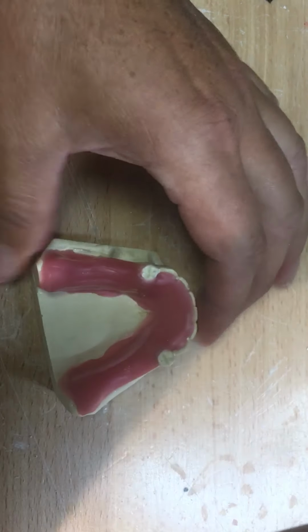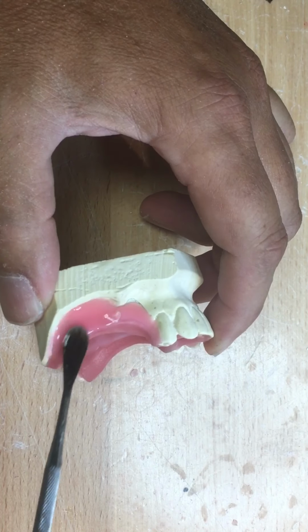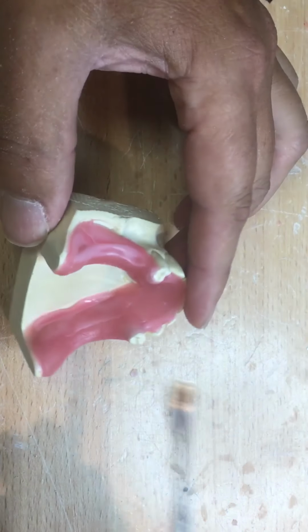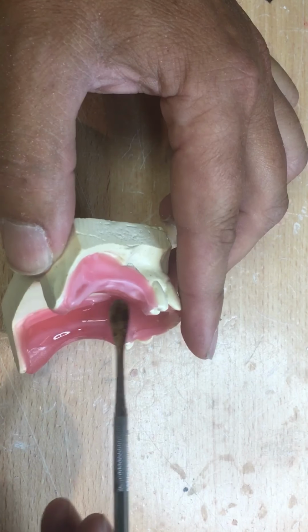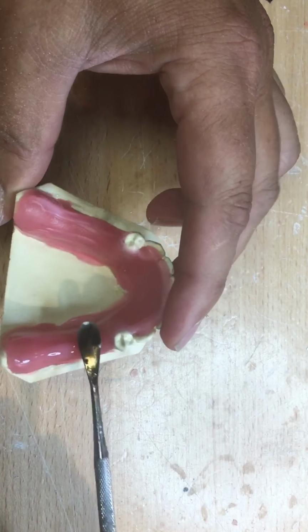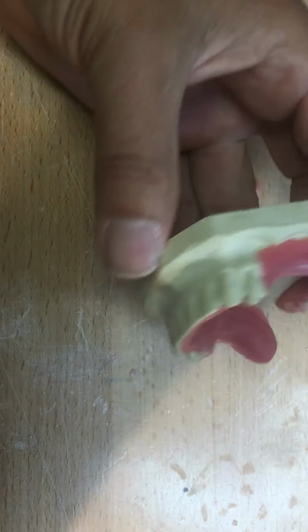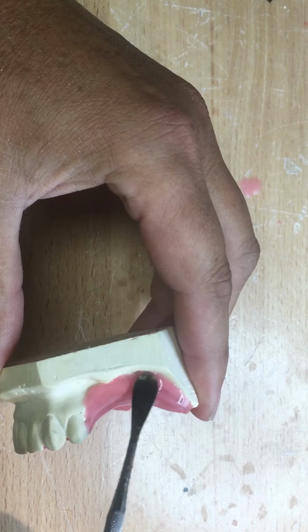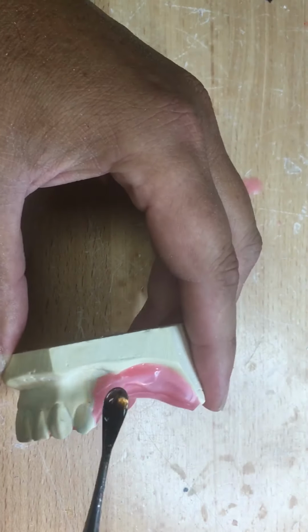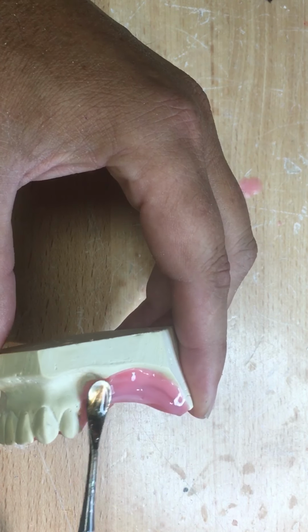So as you can see, I haven't rushed to fold a big blob of wax, which I see many students or beginners rush to do. Everyone thinks there's a shortcut. Well, I just gave it to you. Anything short of this is the long way around. But everyone says, well, that's a waste of time. But really, you could even use that time to tell a nice story to your neighbor, as I've just told you. There's no rush here. Except when you go to rush, you'll just be creating more work.